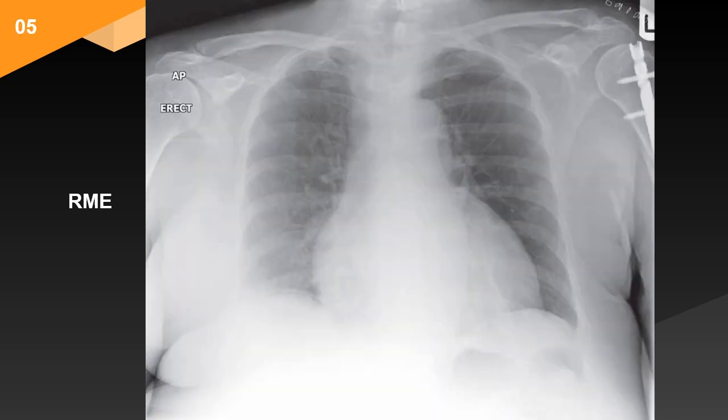This is an anteroposterior erect chest radiograph of an adult female patient. There are several findings of note. Firstly, at the right base the appearance is suggestive of free subdiaphragmatic gas. There is also a rounded mass measuring approximately 3 cm projected over the right heart border. There has been a left mastectomy.